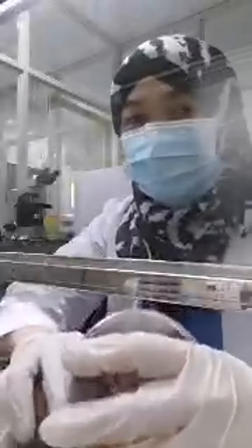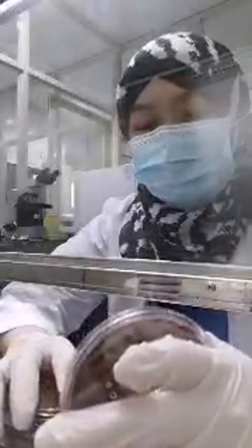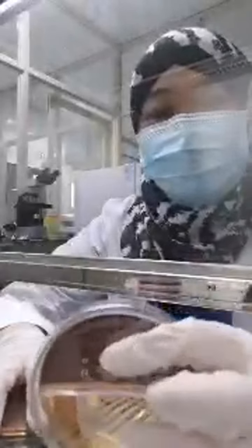Then, these three. SSA, Salmonella Shigella agar, from its name, is specifically for Salmonella and Shigella. And this one is the blood agar. This one is the MacConkey. So there is a growth on the blood agar.